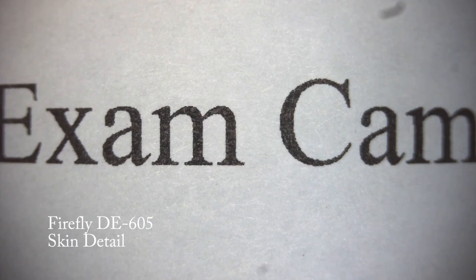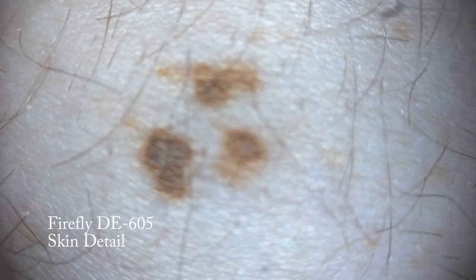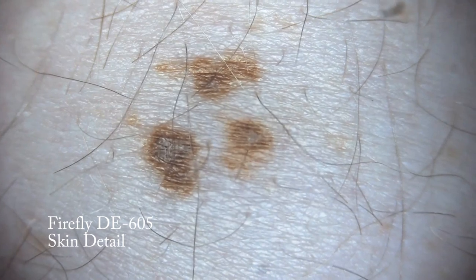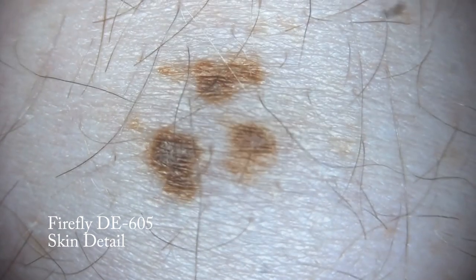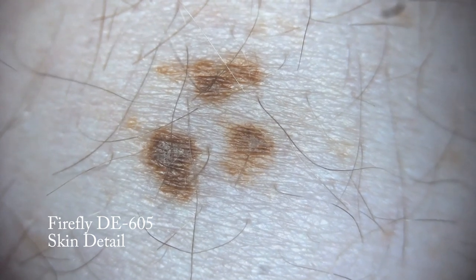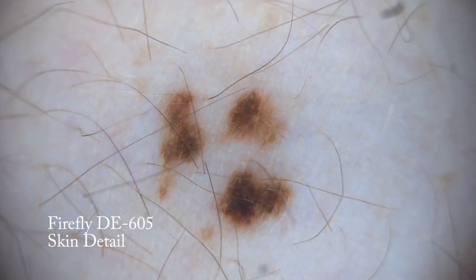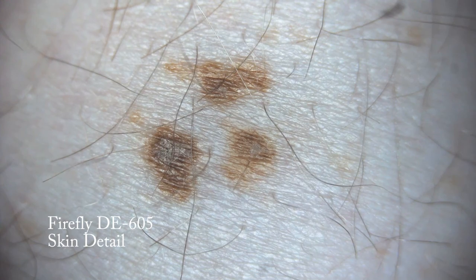In this demonstration, we will show the ability of the Firefly DE605 to capture skin detail. Using the manual focus ring, we can adjust the image until the desired skin features are clear. As we turn the polarization ring, we can see the shine and depth removed from the image for better color detail. Turning the filter back returns the shine and depth of the original image.